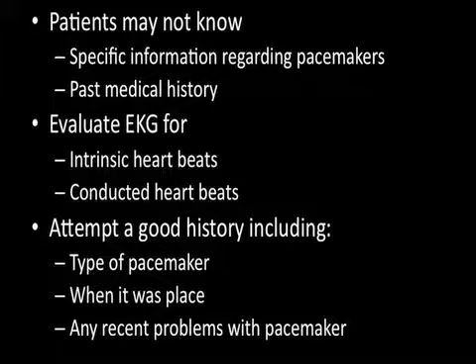Evaluating patients in the field with a pacemaker can be a challenge. Patients may not know the specific information regarding their pacemakers or their past medical history. Evaluate an EKG for the intrinsic heartbeats and also conducted heartbeats. Attempt to get a good history, which includes type of pacemaker, when it was placed, and any recent problems with the pacemaker.